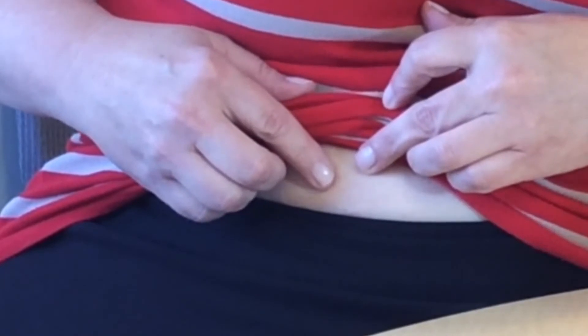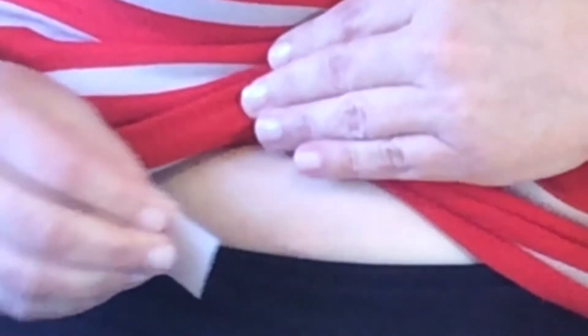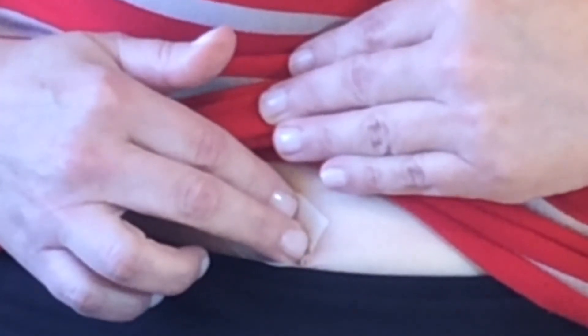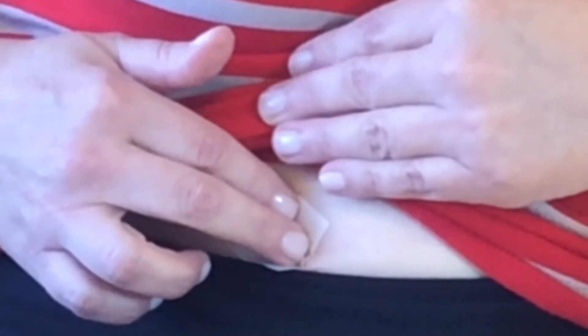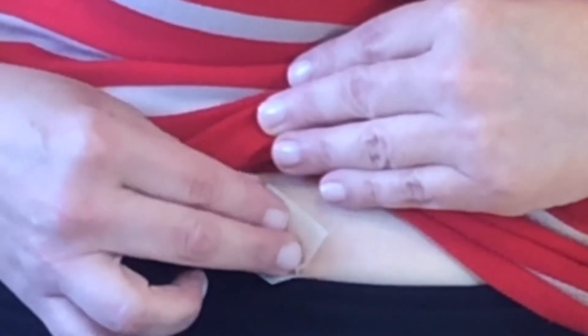If you see a little bit of blood, that's also okay. Just take an alcohol pad or a piece of cotton or gauze and hold it there for a few minutes, but do not rub. Just gently press on your injection site, and your injection is done.